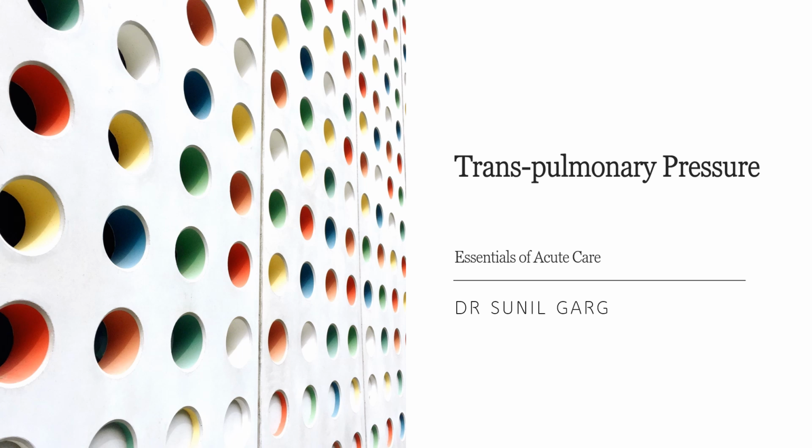Dear viewers, we measure several pressure variables during invasive mechanical ventilation. The aim of measuring these pressure variables is to understand the underlying pulmonary condition, to avoid barotrauma, and to adjust PEEP.